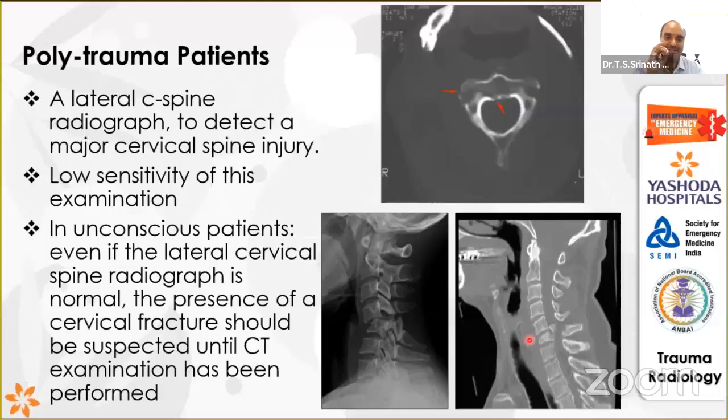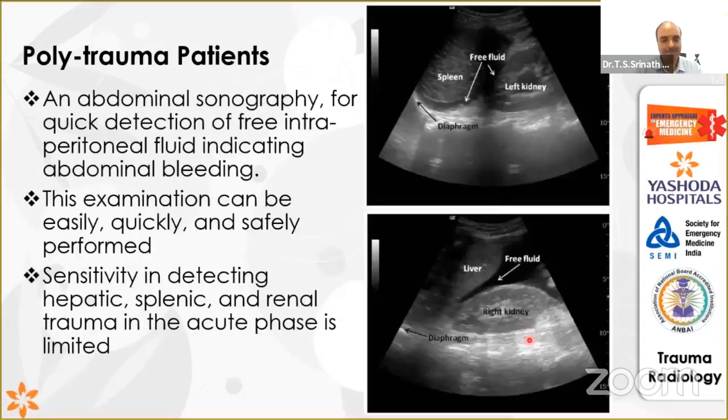Okay, there is free fluid. Then plain abdominal CT may not be useful. So these patients should be subjected to a contrast enhanced CT scan. That makes a difference between your plain CT and contrast CT when you yourself do a FAST scan and say, okay, this is what the patient has. Next slide, please. So the other important thing today is getting the CT scan.